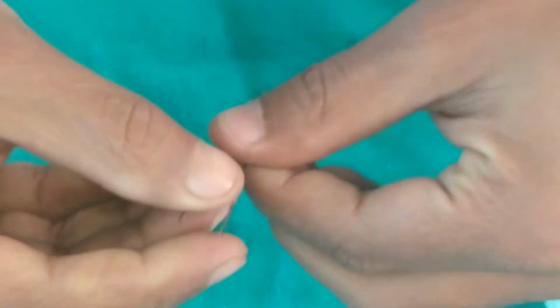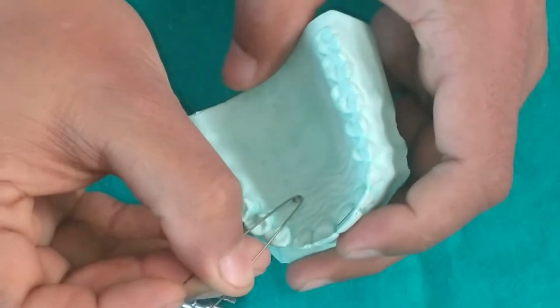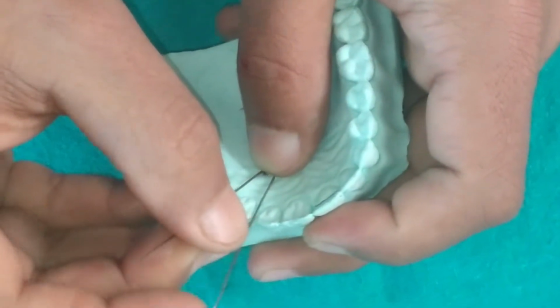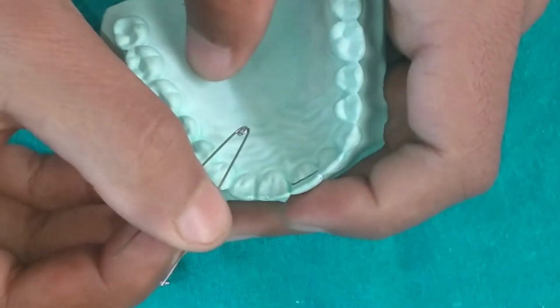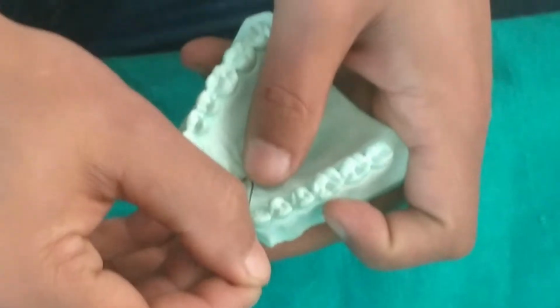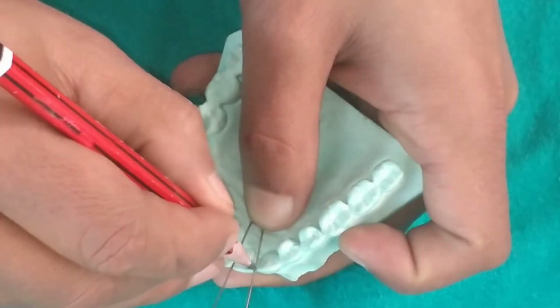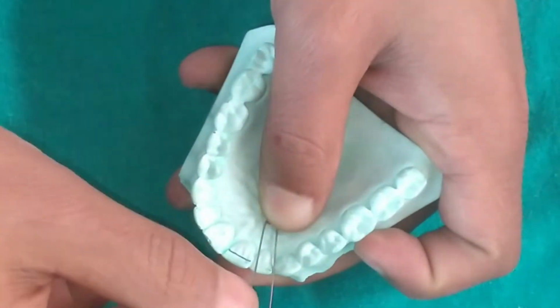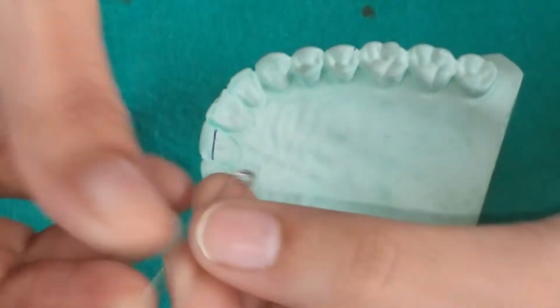Then the helix is in the axis of the canine and the active arm is mesial. So the arm which is mesial will be the active arm. So keeping the measuring the distance from the cervical area of the canine, a helix.